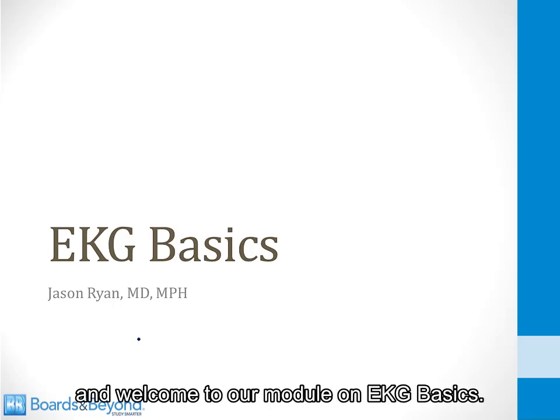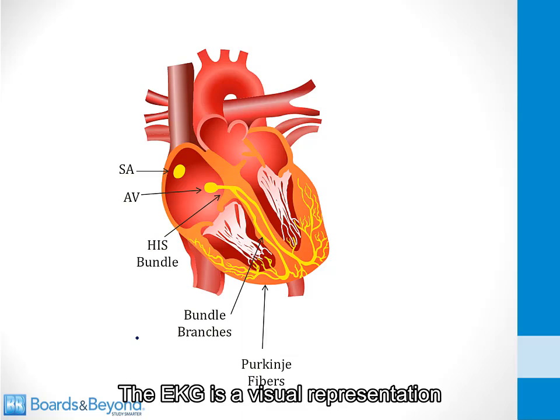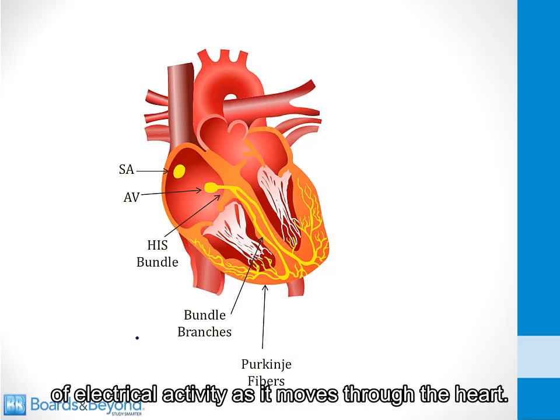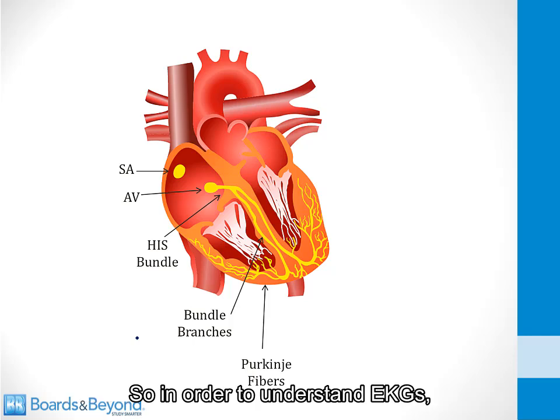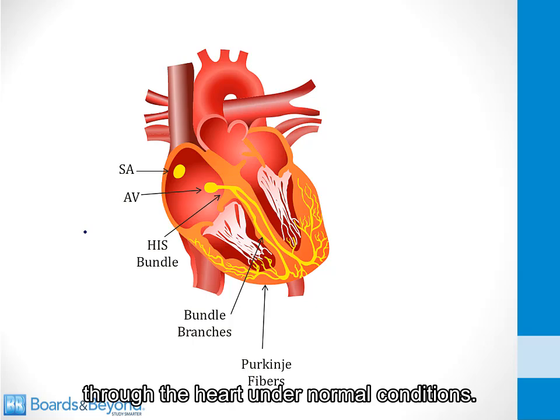Hello everyone and welcome to our module on EKG Basics. The EKG is a visual representation of electrical activity as it moves through the heart. So in order to understand EKGs, we need to review how electricity moves through the heart under normal conditions.